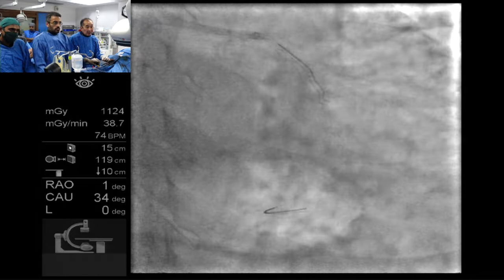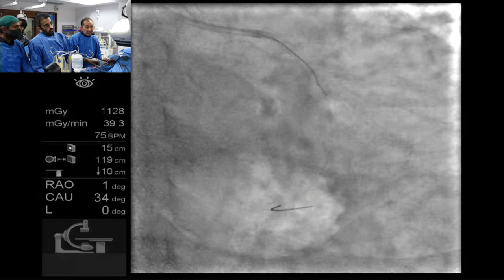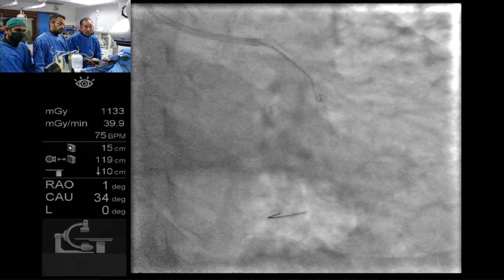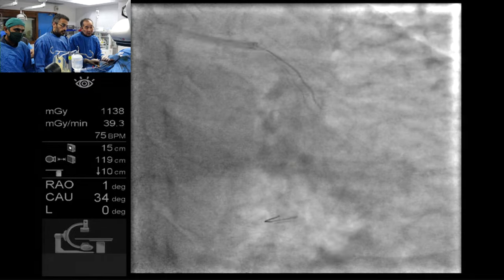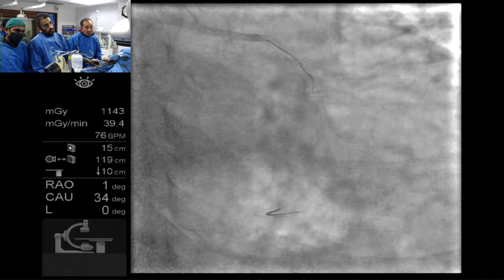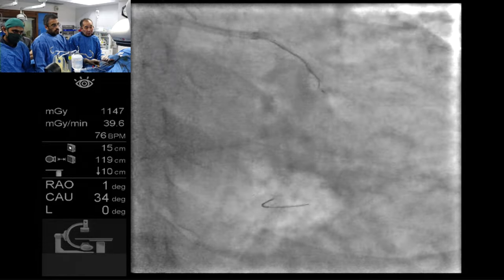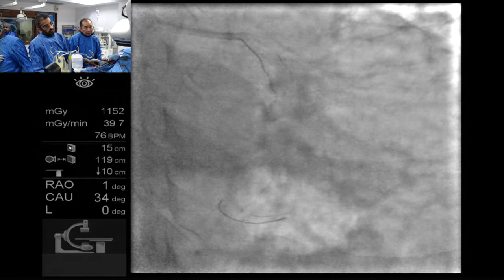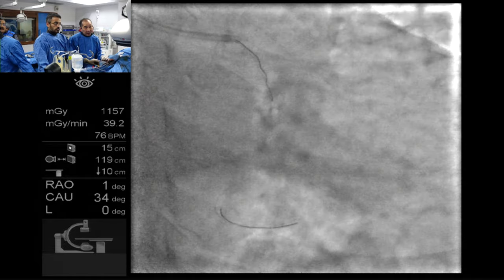Any experience with the angled microcatheter? Yeah, I was just going to say, do we have Supercross 90? Do we have that? Yeah, we have that. Oh, good. Can you have the Supercross standby? 90 or 120, because it'll straighten out. So 90 will be the minimum I would take. The wire is not behaving so good now. So yeah, let's get an angled microcatheter, and then hopefully we can save some time. Supercross, you hear that? Okay, good.